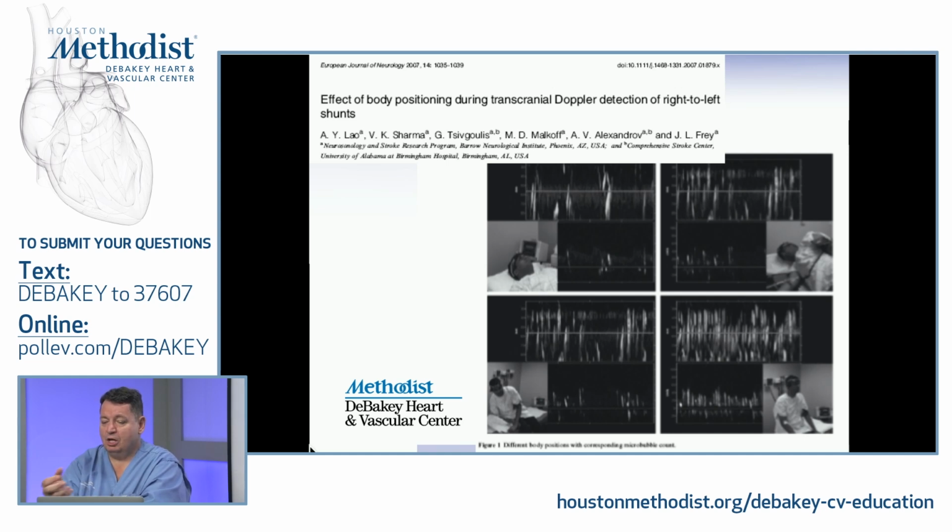After we finished, when I'm taking out the needle, I will make sure one more time that I have blood in it. So that is another confirmation. Indeed, you saw my injection was about 2-3 seconds. So it's extremely fast. This is why I cannot do it in a hand, because it cannot handle high pressure. So it needs to be the antecubital fossa.